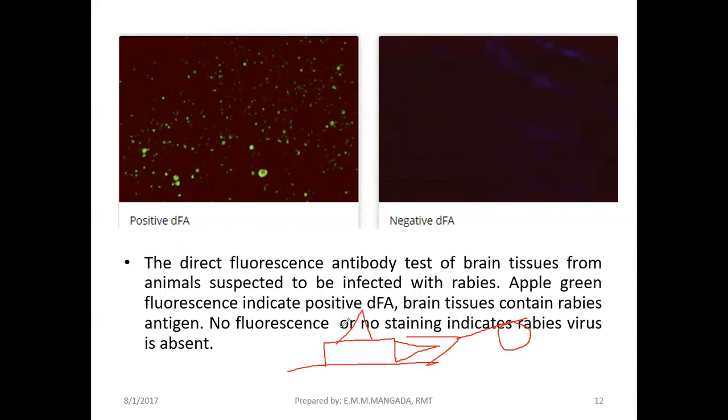Ibabind niya. Itong reagent antibody, magbabind sila ngayon dun sa antigen na nasa ating tissue. So, ganyan siya. But if you're going to wash after incubating the reagent antibody dun sa tissue natin, ang next step kasi doon is washing. Pag wash natin, they will remain dito sa ating specimen. Bakit? Kasi nakakabit na sila doon sa antigen natin. They are already bound. Kaya meron tayong tinatawag na antigen-antibody complex.